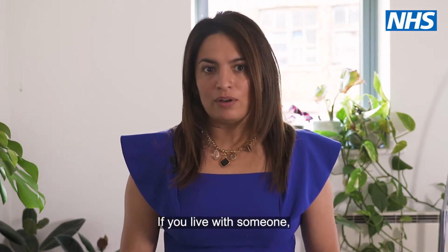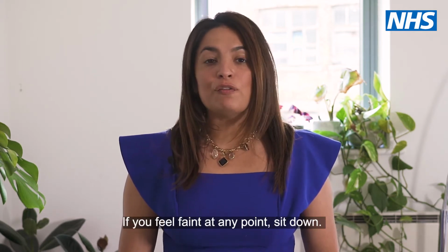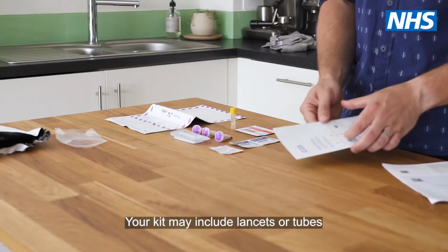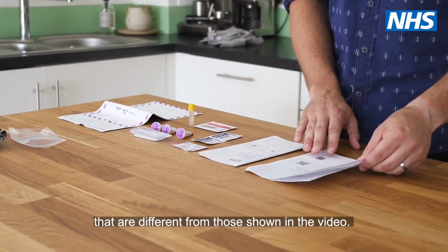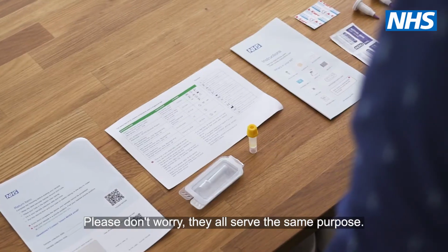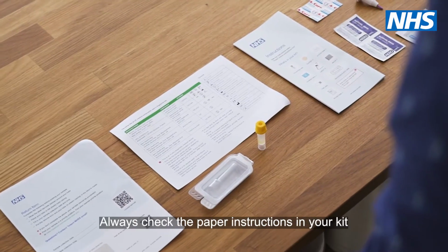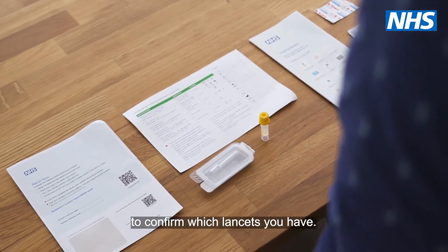If you live with someone, ask for their help while you collect your sample. If you feel faint at any point, sit down. Your kit may include lancets or tubes that are different from the ones shown in the video. Please don't worry, they all serve the same purpose. Always check the paper instruction in your kit to confirm which lancets you have.